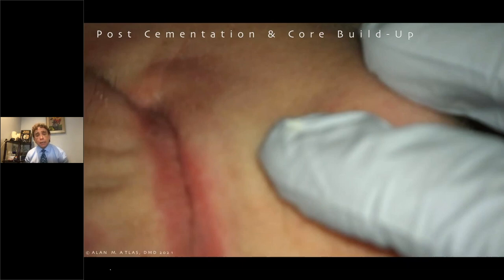If you don't do that, what happens when you go prep the tooth, it may not be cured and your diamond's going to slide right in. And we've seen it because it hasn't cured properly. So make sure you just wait. When you're putting in a cement with a dual cure material, the same thing. Wait 5 minutes before you start checking bite or adjusting occlusion. You will affect the bond significantly if you don't.